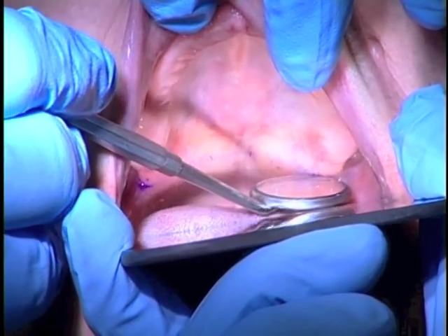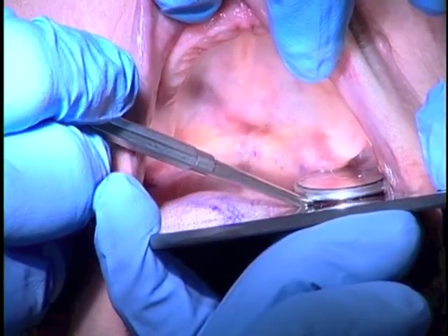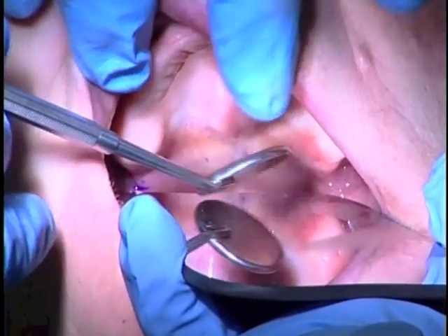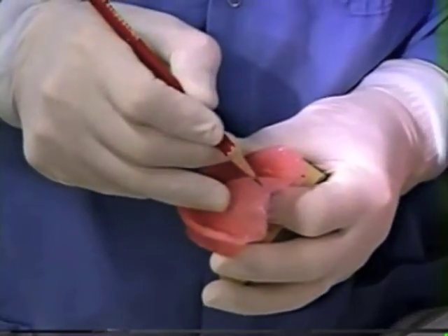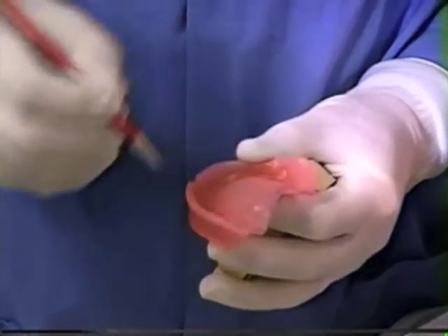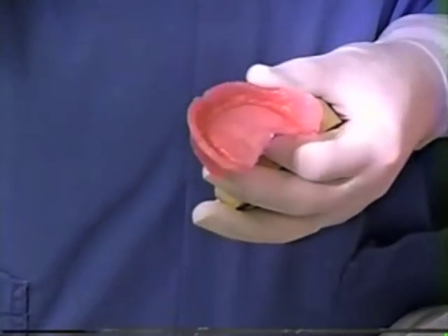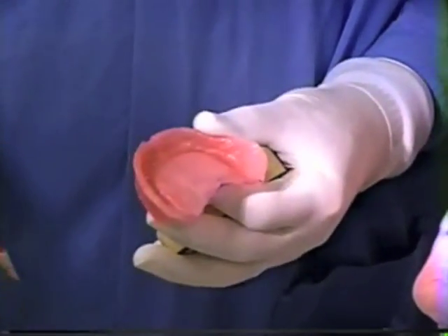Look at the position of that line in relation to the hamular notch. When you evaluate the hamular notch you will feel no bony structure underneath it, just a cleft in the bone, and that line seems to be slightly posterior to that cleft. We have the same situation on the other side. On the patient's right it's about two millimeters too long in the hamular notch area, a little longer on the left. In the midline it's also too long — I'm just going to mark that. Now I'm going to take a burr in the handpiece and cut that off exactly to that line, then repeat the procedure to verify the posterior limit matches the hamular notches and the junction of movable and immovable tissues.